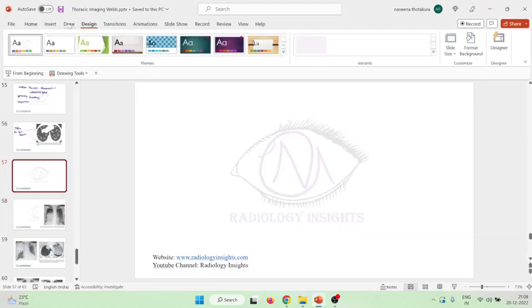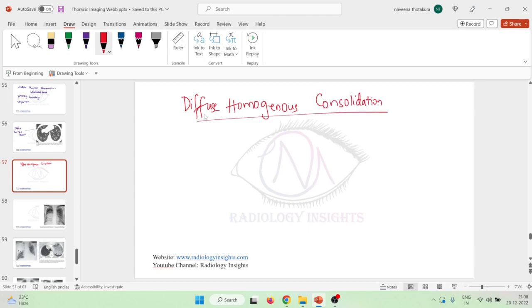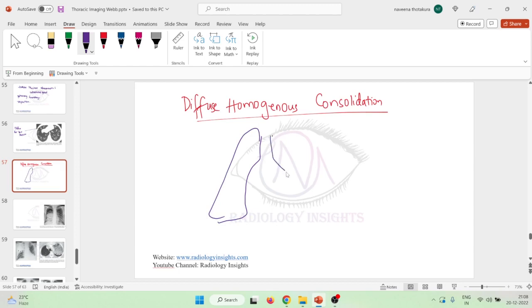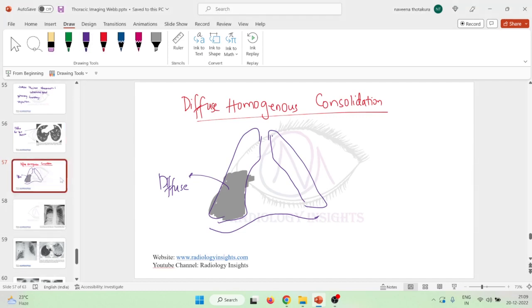Let us now learn about diffuse homogeneous consolidation. In diffuse homogeneous consolidation, this is the right lung and this is the left lung. The consolidation is seen diffusely and it is homogeneous — instead of patchy. The whole field looks the same density, so we call it diffuse homogeneous consolidation.